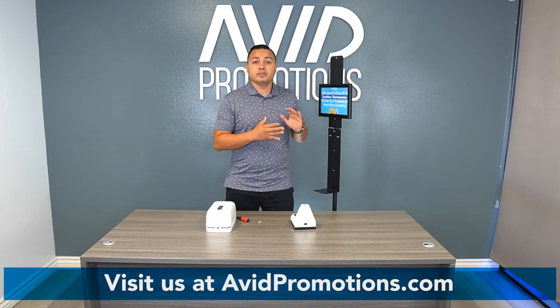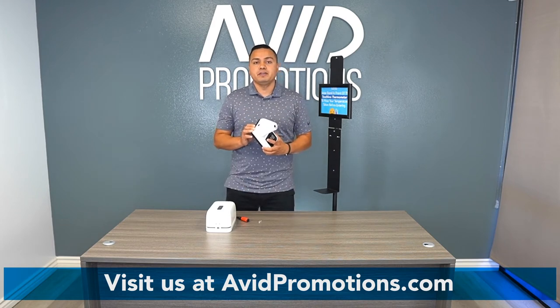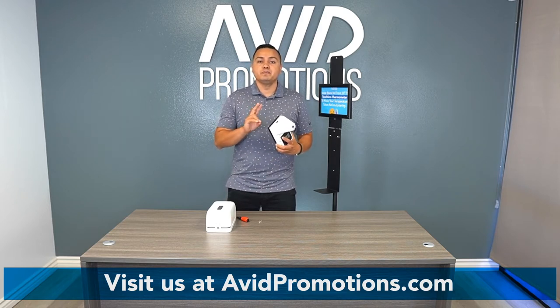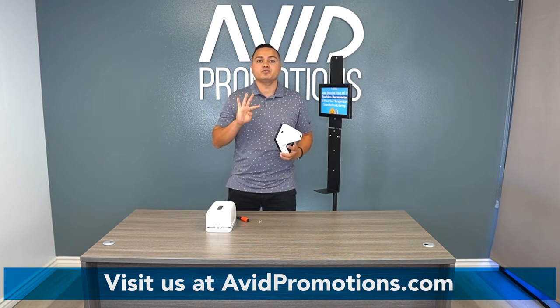Now that we're ready with the stand, we're going to go into the thermometer. I have the infrared model in my hand. The photosensitive model is the exact same setup. The main difference is that the infrared uses two 18650 batteries, while the photosensitive uses four double A's.